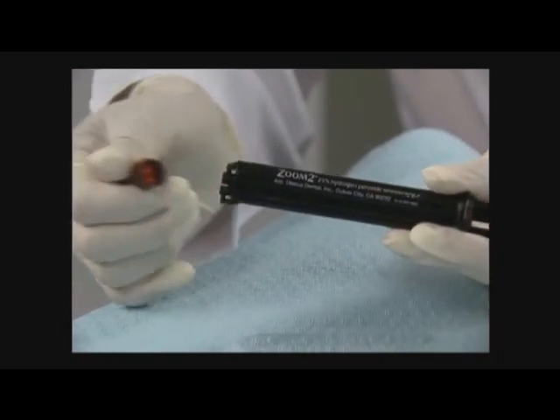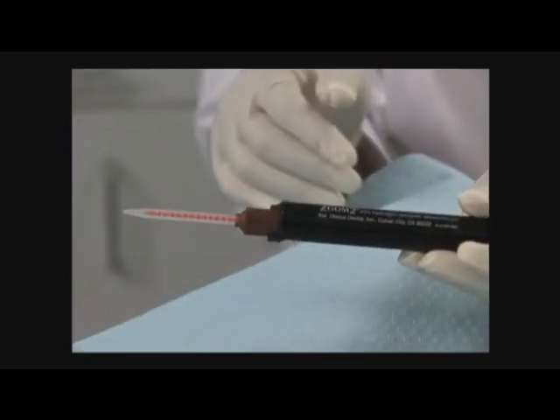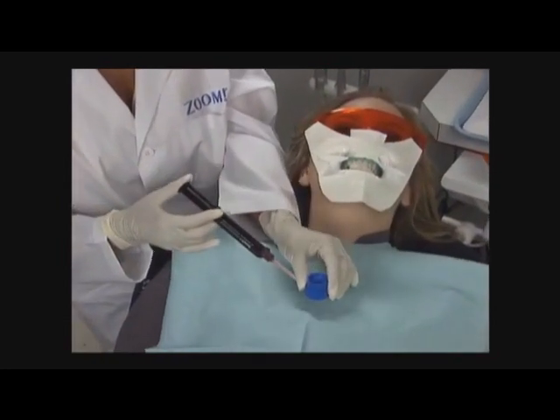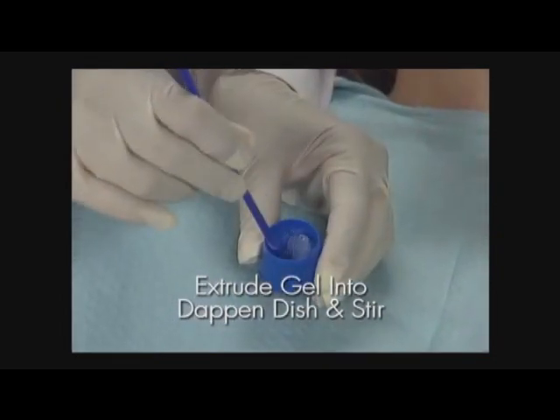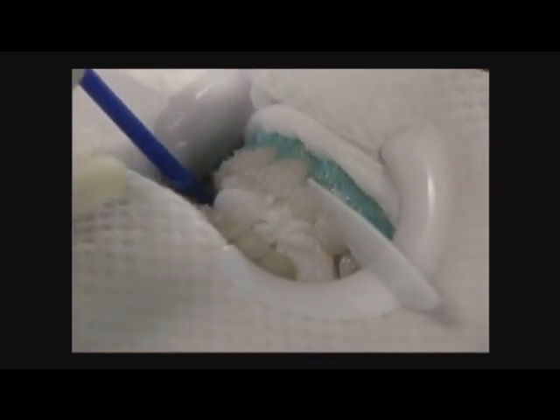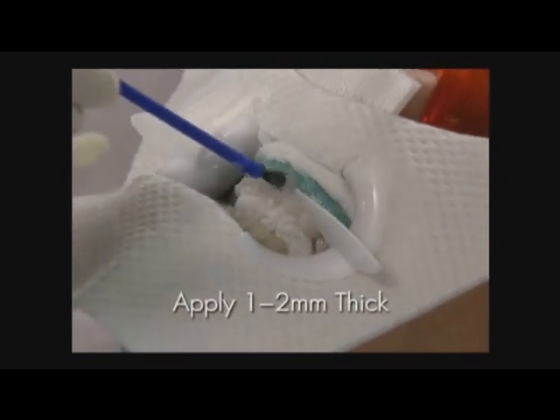Remove the cap by rotating a quarter turn to the right. Place the mixing tip at a quarter angle. Rotate left to lock in place. Do not apply ZOOM gel directly onto the teeth. Extrude the gel into a dappen dish or onto a mixing pad. Use the brush supplied in the kit to stir the gel and apply it to the teeth. Apply the gel to the facial area of all visible teeth, approximately 1 to 2 millimeters thick.